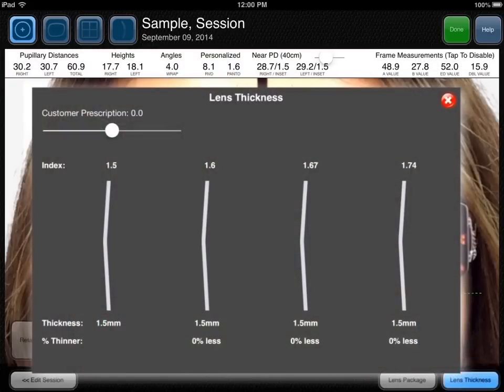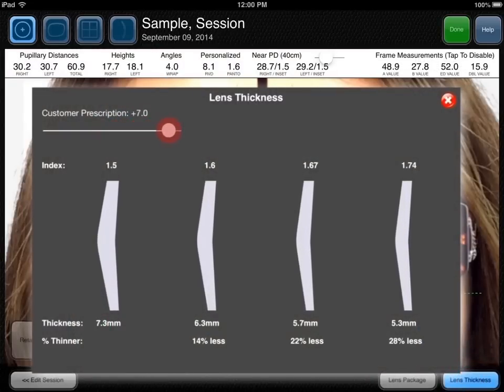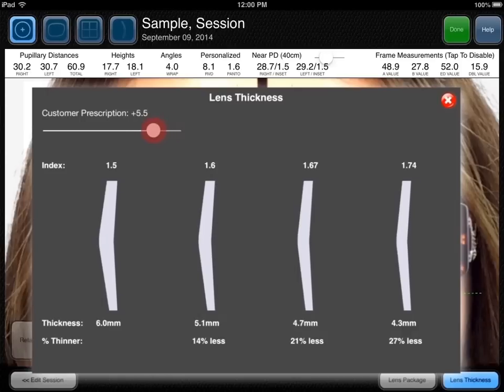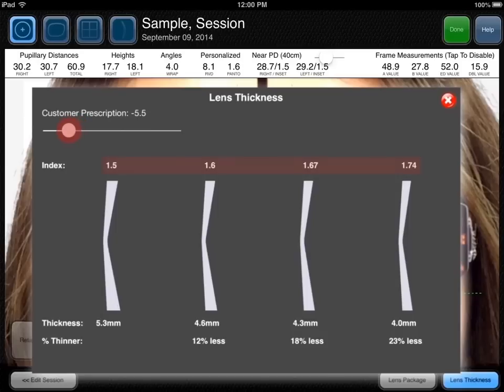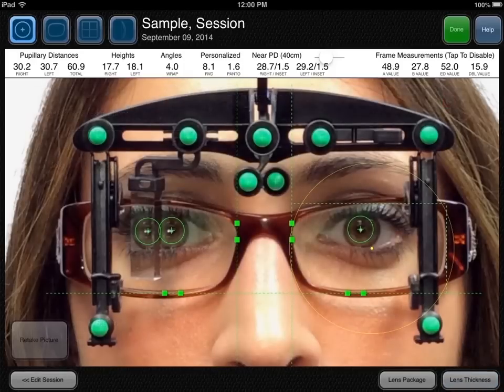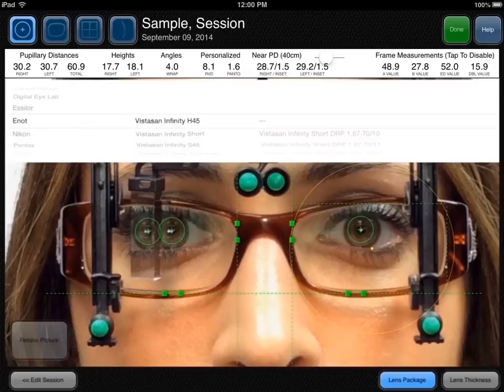In the lens thickness demo, drag the RX slider to select the patient's approximate prescription. This displays the difference in thickness between a 1.5, 1.6, 1.67, and 1.74 lens using the patient's pupillary distance measurements and their frame measurements. You can also touch the Lens Package button to verify whether the chosen lens package respects the minimum fitting height and whether the lens cuts out correctly.